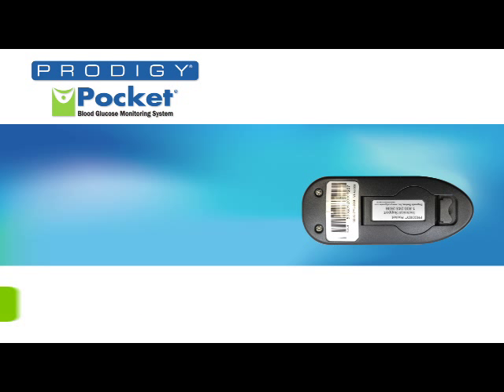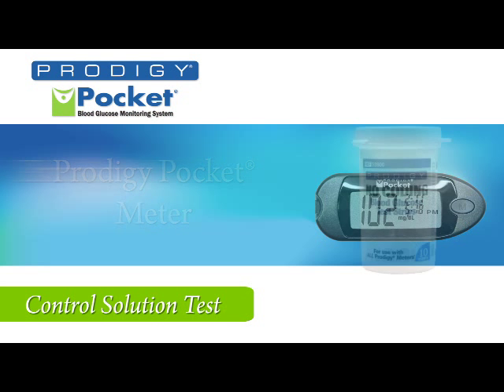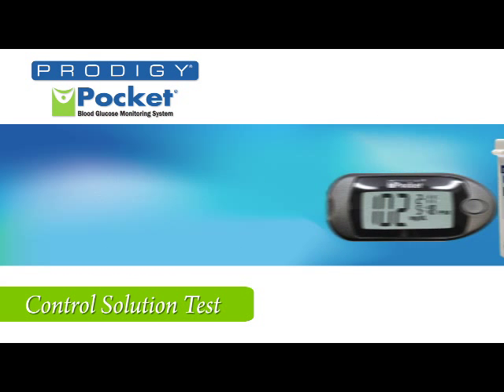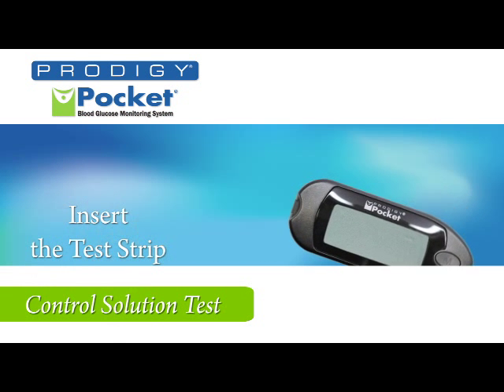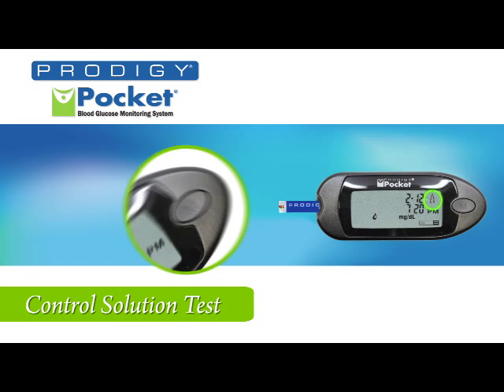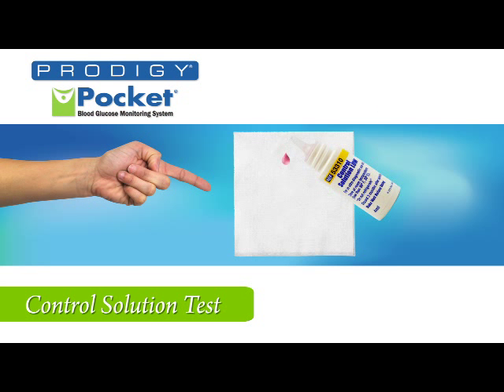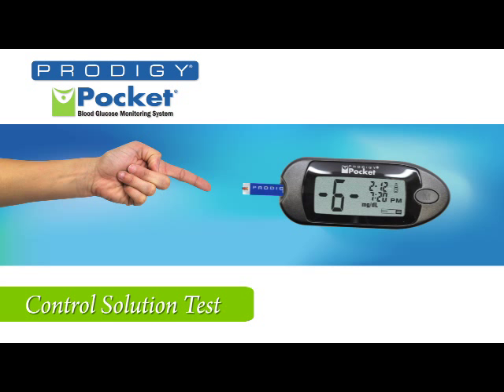Now shut the back and you're ready for the final steps to start using the meter. To perform a control solution test, you will need the Prodigy Pocket Meter, Prodigy No Coating Test Strips, Prodigy Control Solution, and a tissue. Remember, only use Prodigy control solution and Prodigy test strips with the meter. Insert a test strip into the test strip slot. Next, press the M button to enter control solution mode. Shake the bottle and discard the first drop on your tissue. Apply the second drop to your finger and then to the test strip. The meter will count down and report the test results.